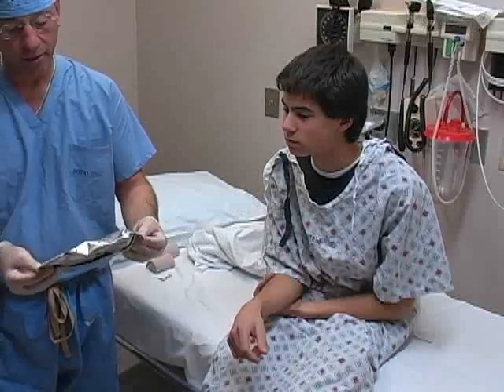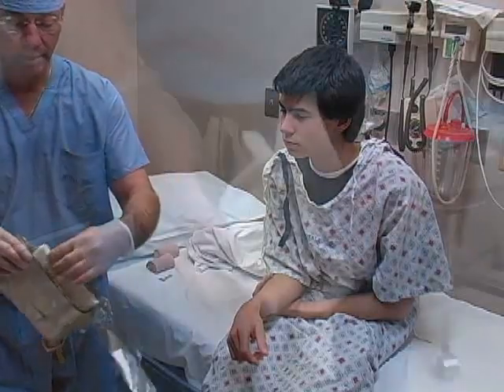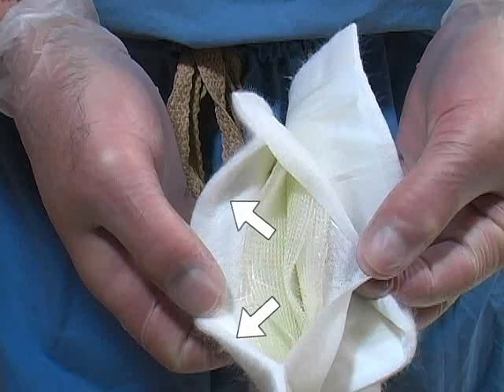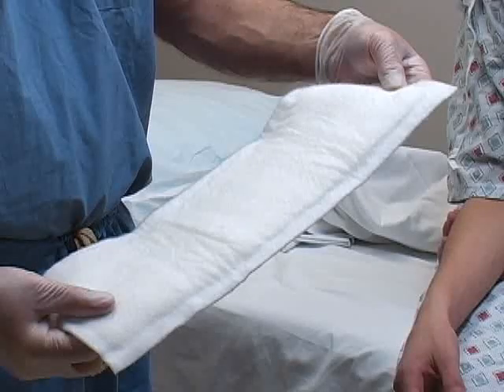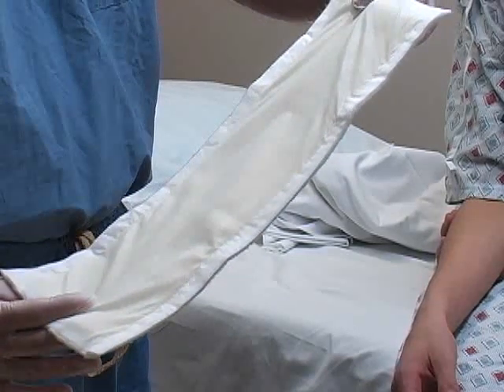A variety of prefabricated fiberglass splinting materials are available. In general, these splints contain multiple layers of fiberglass surrounded by padding material. Note that there are two distinct sides to the splint — the padded side must be placed next to the patient's skin, while the other side is not padded and is intended to prevent the fiberglass from sticking to the elastic bandage.